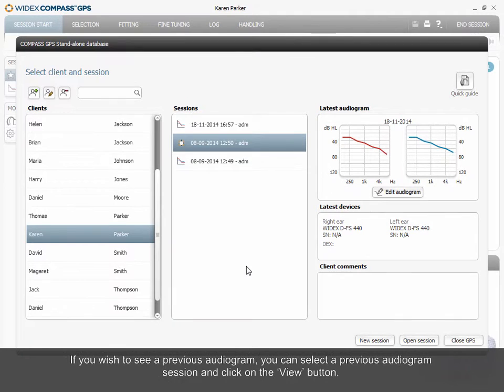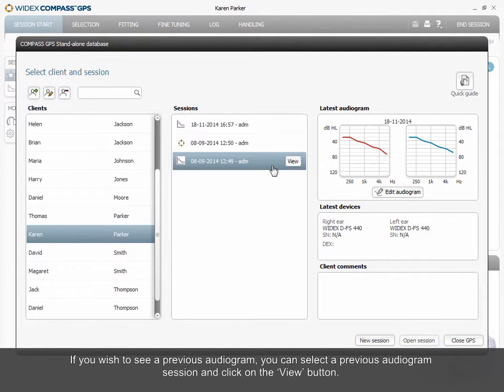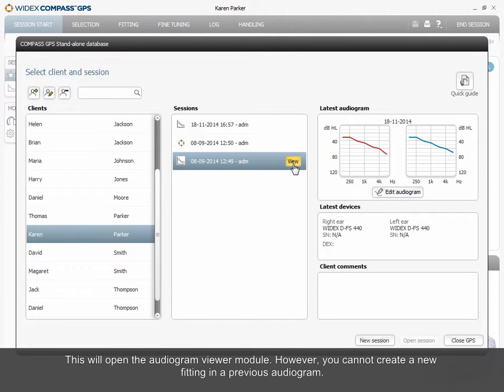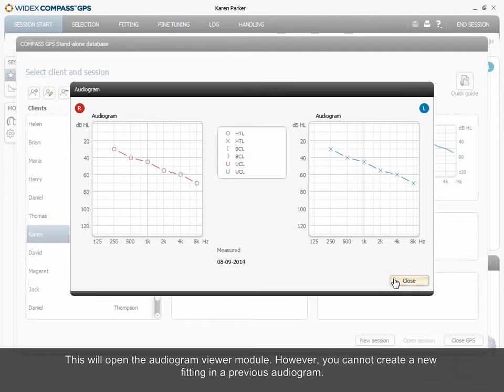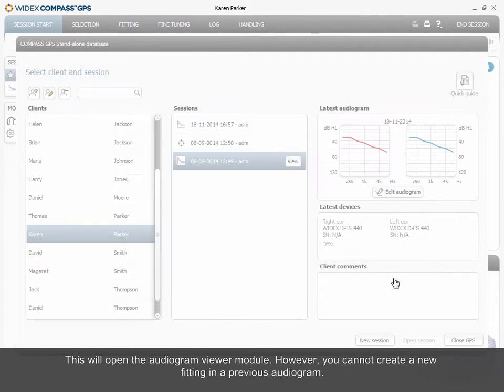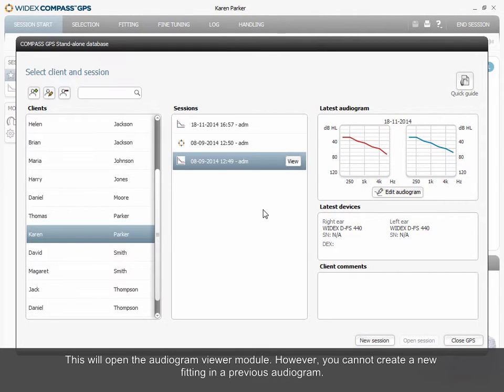If you wish to see a previous audiogram, you can select a previous audiogram session and click on the View button. This will open the Audiogram Viewer module. However, you cannot create a new fitting in a previous audiogram.